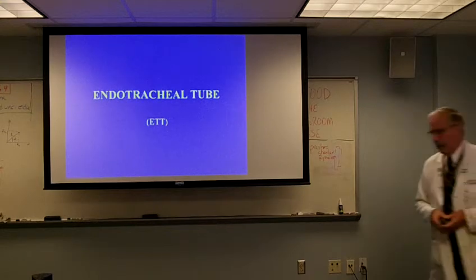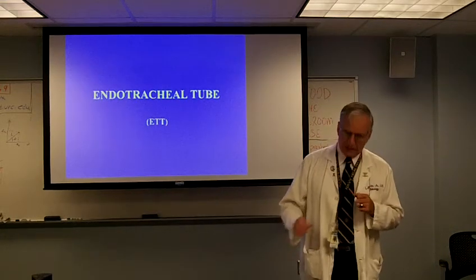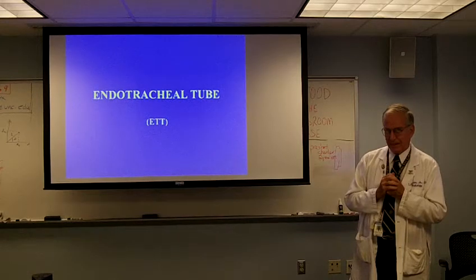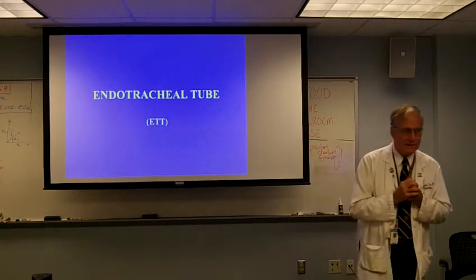Endotracheal tube. Holly, if I flex the head like so, which way does the tube move? Does it move up or down? I'd say up. Okay. Steve, what do you say?